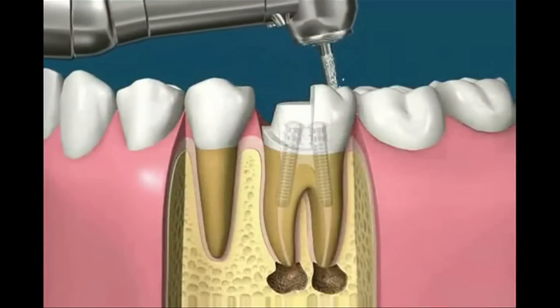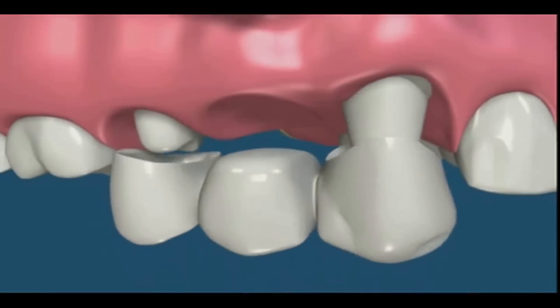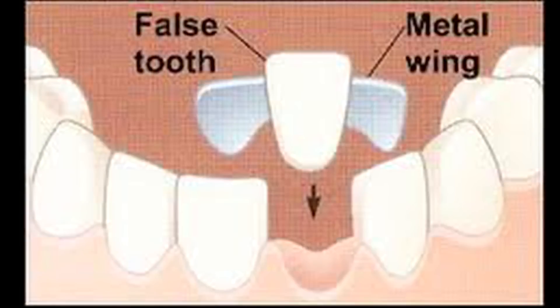Essentially, we prep a tooth like you would for a crown, and you have a fake tooth connected to those two crowns. If the adjacent teeth are healthy and you don't have to prep them, you can simply put a little tab on the back of the teeth, which is a minimal prep, and have the tooth attached that way.